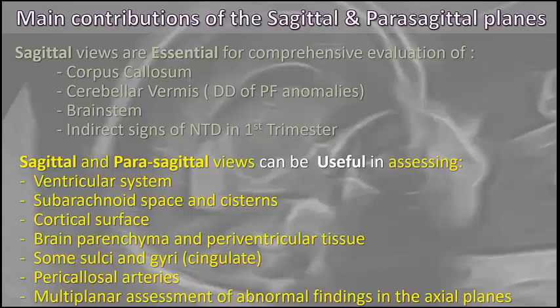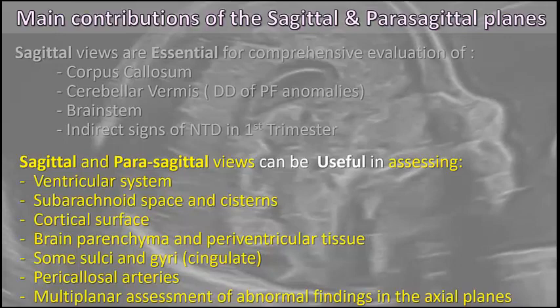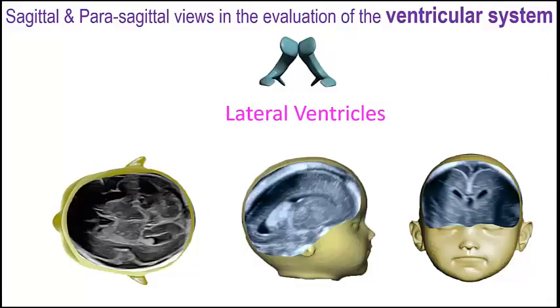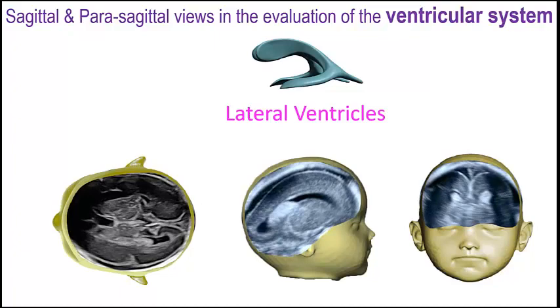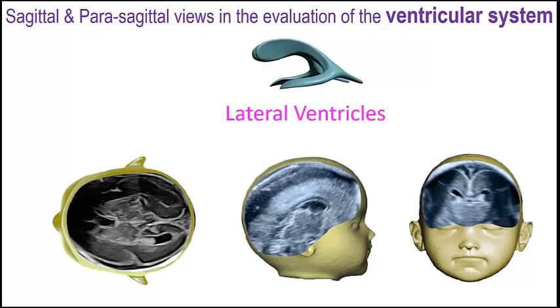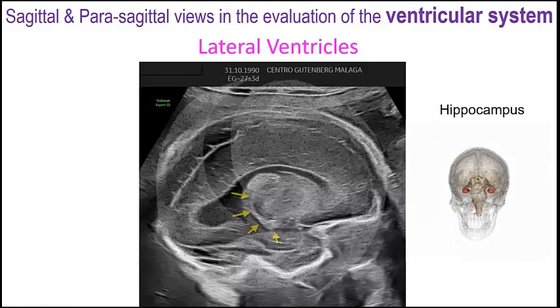There are other scenarios in which the sagittal and parasagittal planes can assist us, such as for the evaluation of the ventricular system. In the routine exam, we usually evaluate the lateral ventricles in the axial plane, but for a complete assessment we need a multiplanar evaluation. The parasagittal planes allow a complete visualization of the lateral ventricles, showing all three horns at the same time, and this parasagittal plane is also the best for the visualization of the hippocampus.